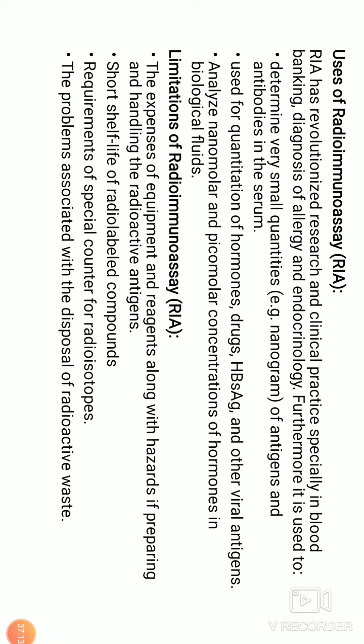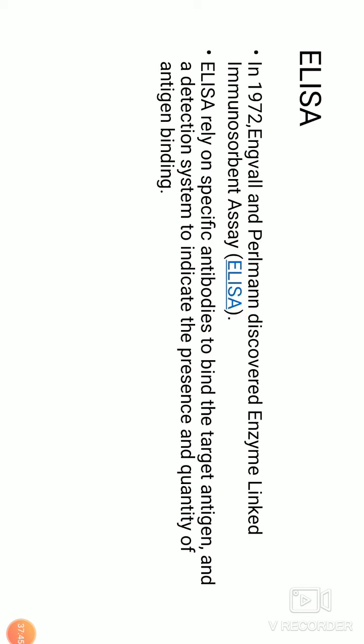It can analyze nanomolar and picomolar concentrations of hormones in a biological sample. The limitation is that you are using radioactivity, so you have to think about the shelf life also. Iodine-125 has 60 days, but still you have to think about shelf life and the problem associated with disposal of radioactive waste, and then you need a sophisticated instrument for reading the results. So those are the major drawbacks of this assay.